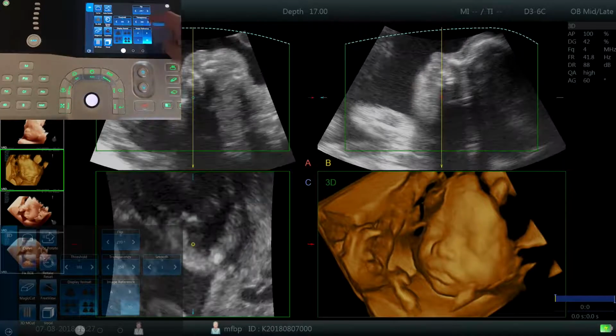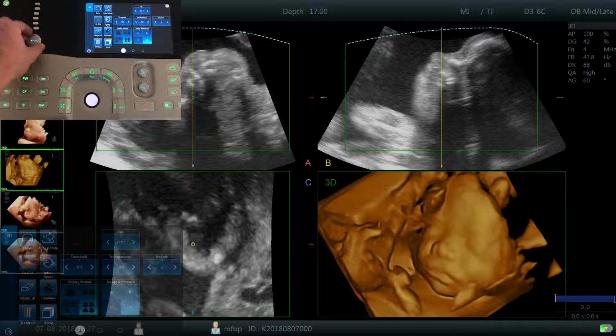Other things that you can experiment with are the transparency. To make it a bit more solid, we increase the transparency, and this is the other extreme. If we totally decrease it, it looks like that. Okay, so that's looking good. If we want to smooth it out a little bit more, we can do so, but I don't think we really need to do that.